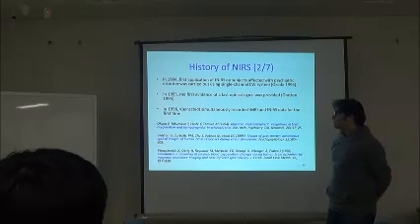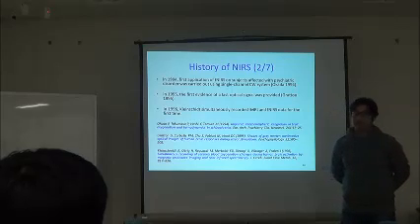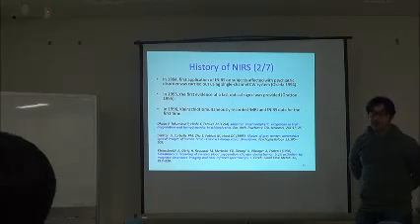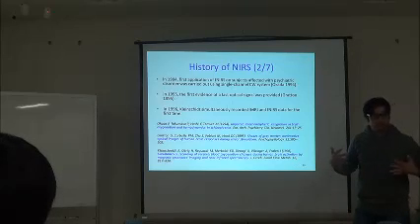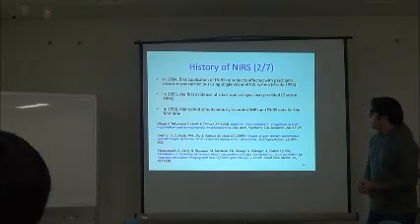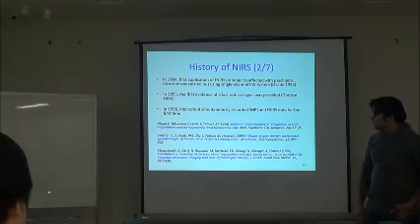In 1996, there was a first study in which they combined the 2 modalities, fMRI and fNIRS. So we can also use fNIRS in combination with other modalities like EEG, fMRI, and others. And these are the references of those papers.